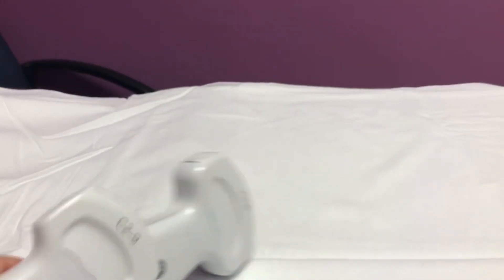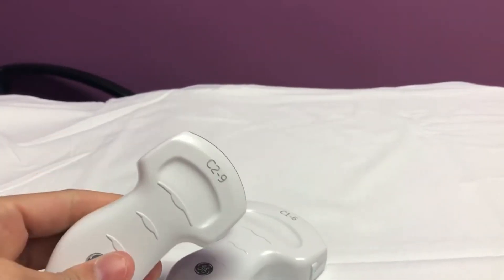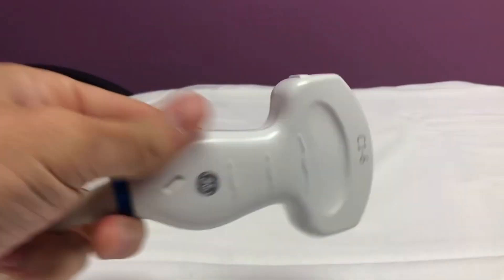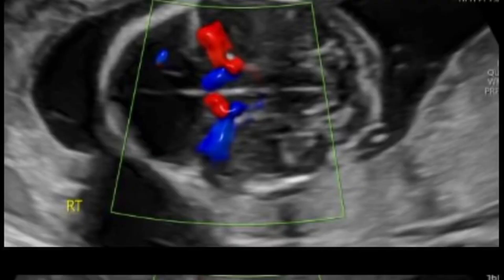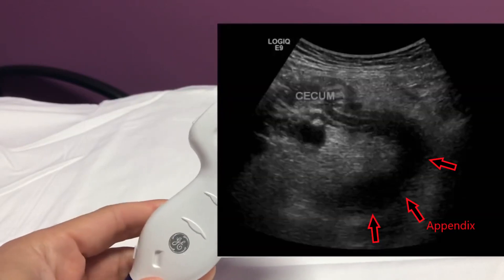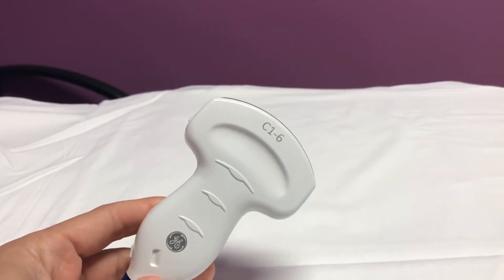We have an example of two curved transducers. We've got the C16, which goes up to 6 MHz, and the C29, which goes up to 9 MHz. I don't really use the C29 that much. I think the C16 is great for all of your abdominal needs — obstetrics, even if you're doing an appendix on a bigger person and having trouble seeing it, you can try this, though most of the time it probably won't be successful. But this is the main abdominal probe.